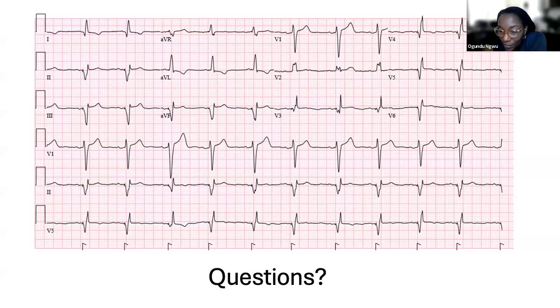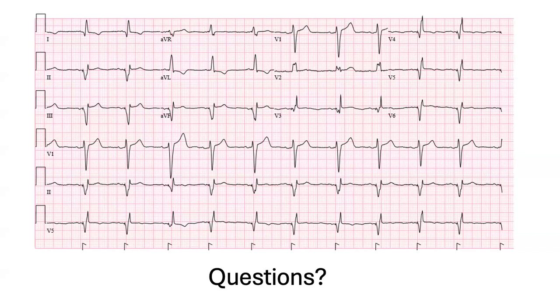I got your point. Yeah, because you have to remember that the can is important, right? If you're going to put in a pacing lead in the left bundle branch area for your CRT, it's going to be a bipolar can for the pacing for the LV lead port. You can't use a quad pole can, right? So you have to be very aware of what you're doing before you open up the generator. If you're taking a stepwise approach, first of all, you have to determine before you open up the generator what kind of lead will go there. And then you open up your generator, and the generator has to be able to fit what you're eventually going to do. So for a quadrupolar generator, you can't say, okay, I'm going to maybe upgrade this in a few months to possibly have a left bundle area can. You can't do that because it's going to be a pacing lead and it has to be bipolar. So those are the things you just have to think about.